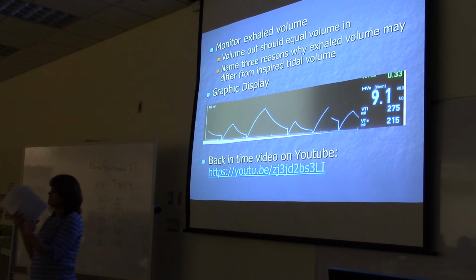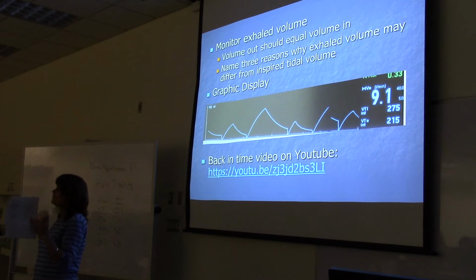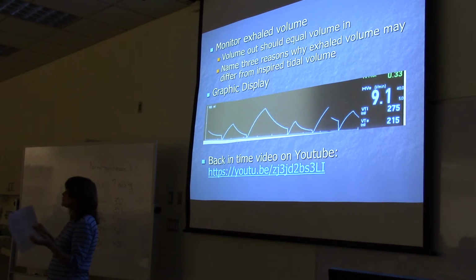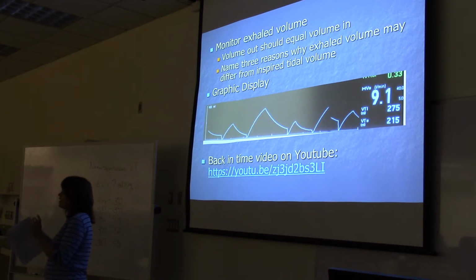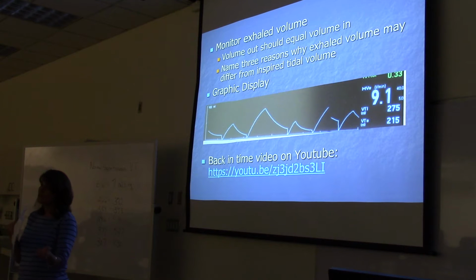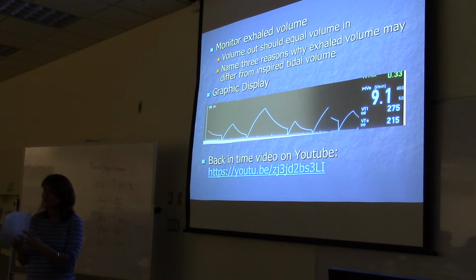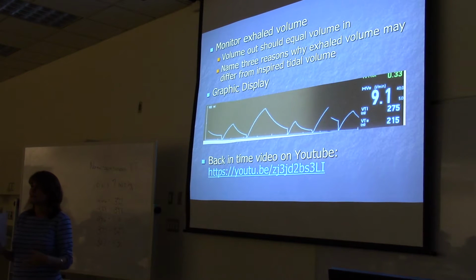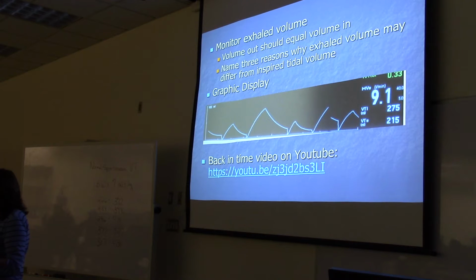patient, and the patient's body warms it up, saturates it with water vapor, and now once that's done, the volume has expanded. Usually about 50 mLs for every 500 ml tidal volume. So typically you should put in 500 and see about 550 mLs come back, only because the heat and the moisture expanded it. So that makes sense? Warmth and humidity expand a volume?